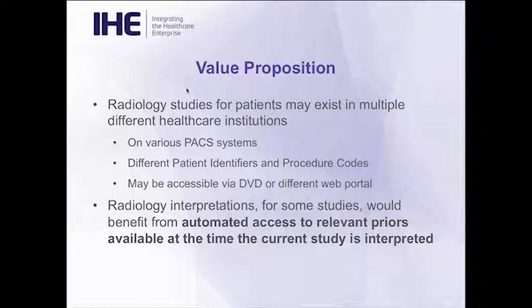The different studies may have different patient identifiers, different procedure codes. Today, those studies may be accessible through a DVD. You often hear it called a DICOM CD or a DICOM DVD. Or even accessible through a web portal. But that's not the same as having a radiology comparison, which is available side by side on the Radiology PACS workstation for radiology interpretation at the time when that study is being interpreted.